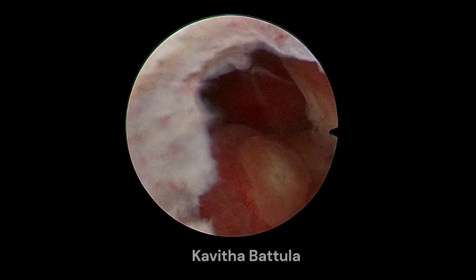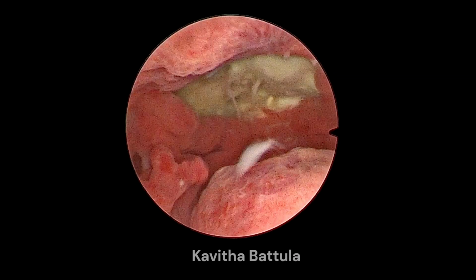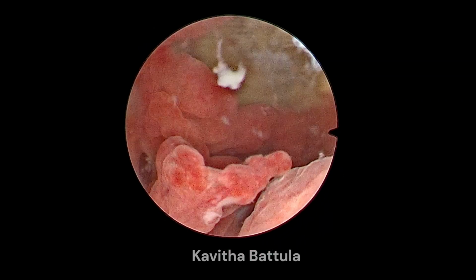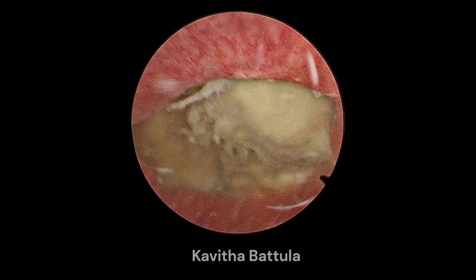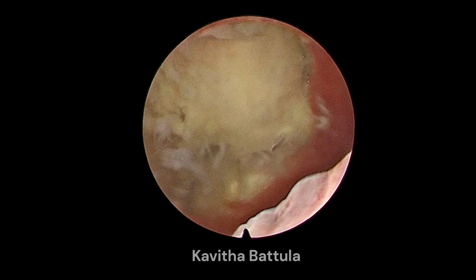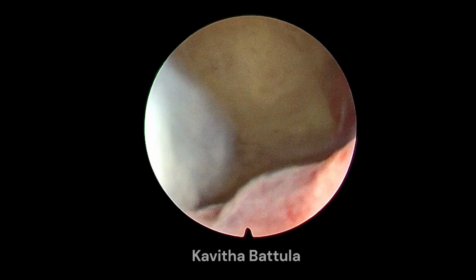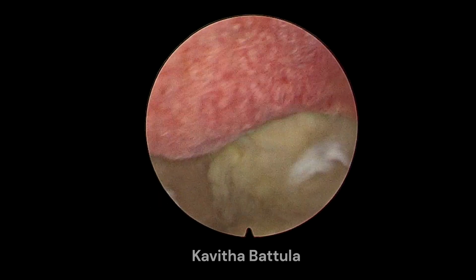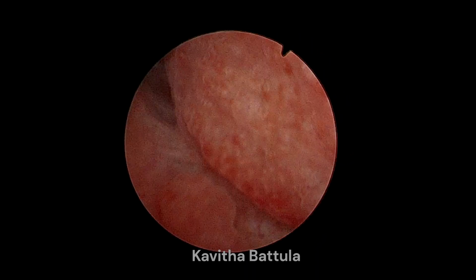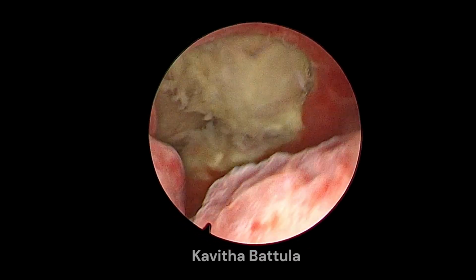So, in these cases of multiple larger fibroids, the uterine cavity is enlarged. When we enter the uterine cavity, we have to look for the exact location of the fibroids, the size, and there may be multiple fibroids. So, each one we have to delineate, look for the ostia, and then see the internal os. And in respect to the internal os, we have to locate the fibroids. Here we can't see the right ostia, but the left ostia was seen. So we proceeded for the submucous fibroid resection.